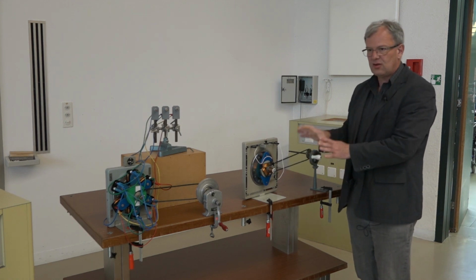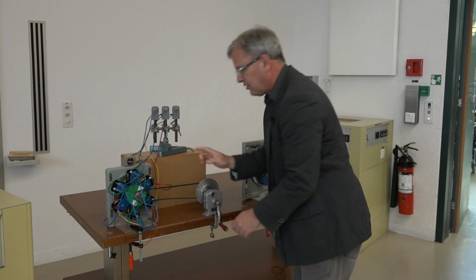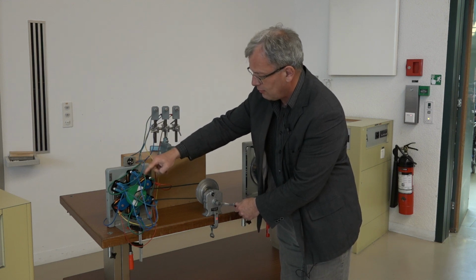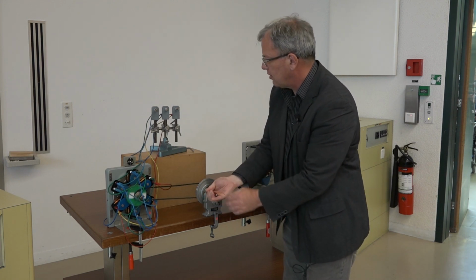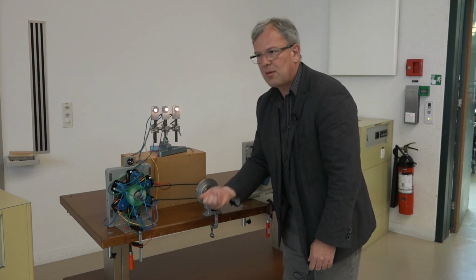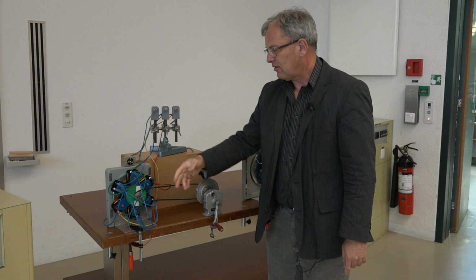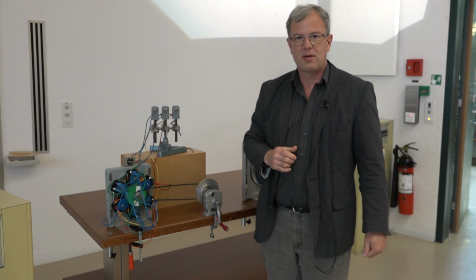This is one situation that does not correspond to what we have in magnetic resonance. The situation that we have in magnetic resonance is more like this one. Here we have the magnet in green, and the coils that pick up the change in magnetic flux are around it. As I turn this, we will see the induced voltage by the light bulbs up here. So this is like the magnetization in magnetic resonance. We have a change in magnetic field flux. This magnetic flux is picked up by the coils, and this produces the induced voltage, and in this case produces light, which of course we can't do with MRI.